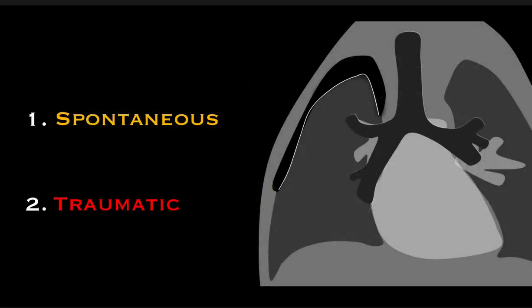I mention this and go on and on about various causes because I want you to remember your pretest probability. Is this a patient who could develop one of these things? Because as you're going to see as we go through this talk, the findings for pneumothorax when they're small can be subtle. So if you have increased suspicion, you spend a little bit extra time looking closer in those target areas that we're going to discuss now.